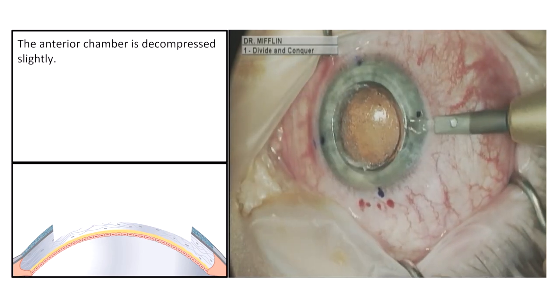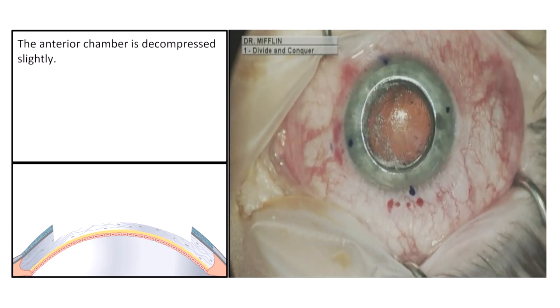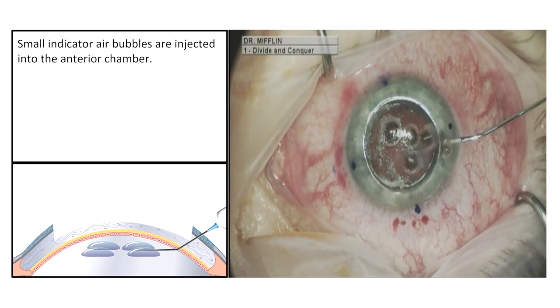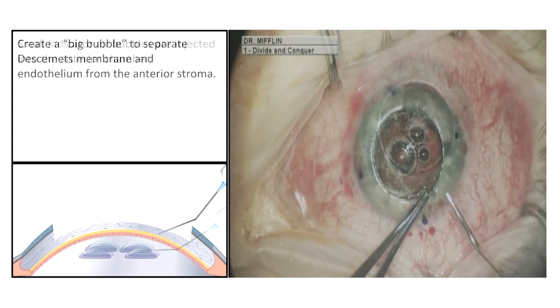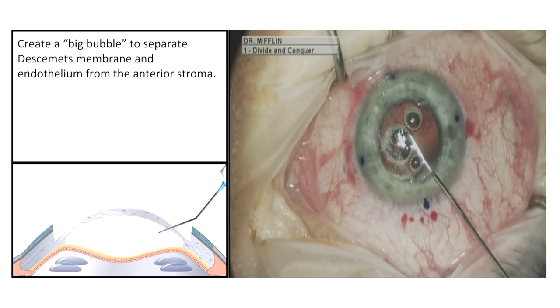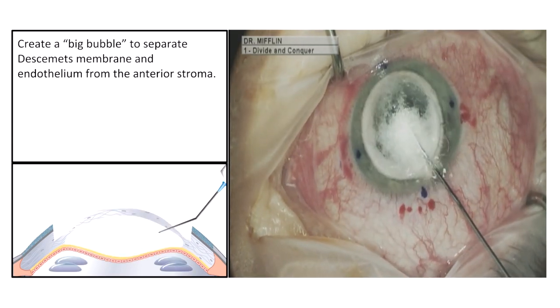The anterior chamber is decompressed slightly. Small indicator air bubbles are then injected into the anterior chamber. Then a big bubble is created to separate Descemet's membrane and endothelium from the anterior stroma.